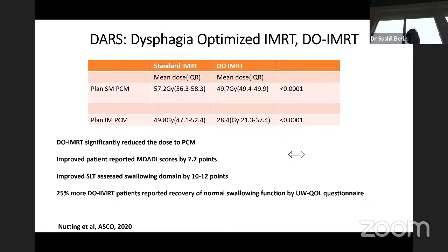Now, the way you use it is a bit different, but the auto flash is a module which is available in both. You commonly use it for breast cancer patients when you're trying to do IMRT. You commonly use it for cancer of the vulva when you're trying to account for organ motion, swelling and uncertainty. So those modules are available. If you think skin is at risk, you can add the bolus. If you think skin is not a risk, but you want to make sure you're not missing the node with day-to-day setup, then you can use the auto flash. Either way, you need to extend the isodose line outside the patient's body.